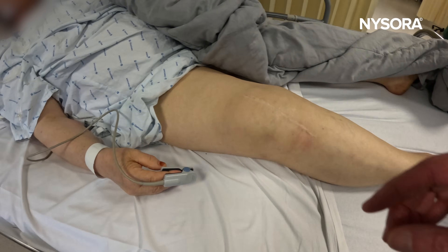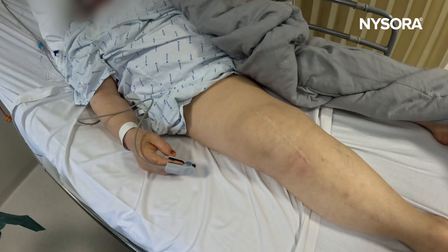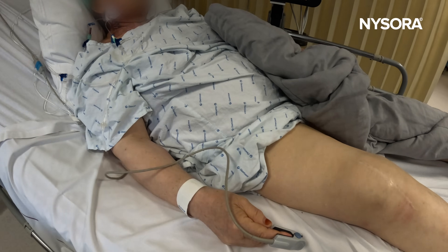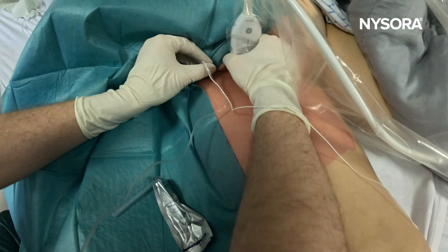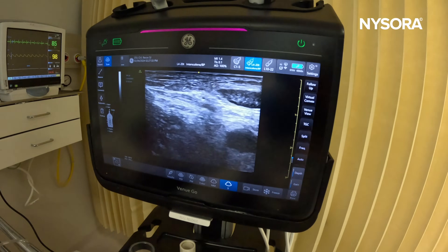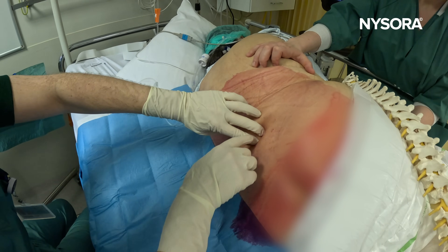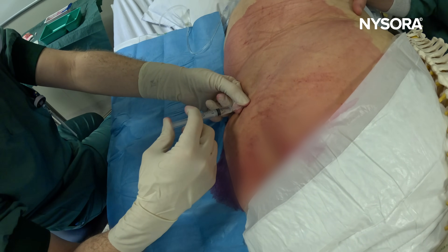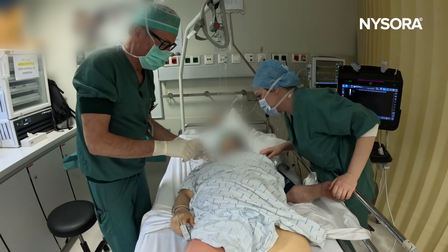In this video, I will take you through the anesthesia management of a septic patient with an infected knee prosthesis who is scheduled for removal of the prosthesis. These patients are often very ill, have fever and difficulty breathing. I will take you through the performance of a femoral nerve block for patient positioning and postoperative analgesia, and through spinal anesthesia in the lateral position using a paramedial approach and 10 milligrams of isobaric bupivacaine 0.5%, which results in over three hours of anesthesia. The use of both spinal anesthesia and femoral nerve block helps manage perioperative stability and pain, which is crucial in such critically ill patients.